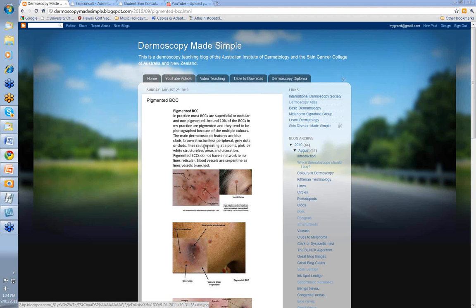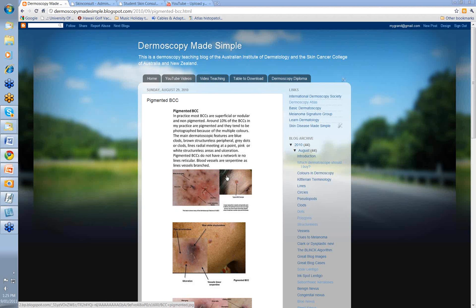What are the main dermatoscopic features you're going to see? Well, there's a variety of things. Mainly: blue clods, brown structureless peripheral areas, grey dots or clods, lines radial meeting at a point — not only peripheral but within the lesion itself — and then pink or white structureless areas and some ulceration. You're much more likely to get ulceration with pigmented BCCs than with melanomas. Remember, pigmented BCCs do not have a network, so there are no lines reticular within them. Any blood vessels are going to be serpentine, generally as lines vessels branched.